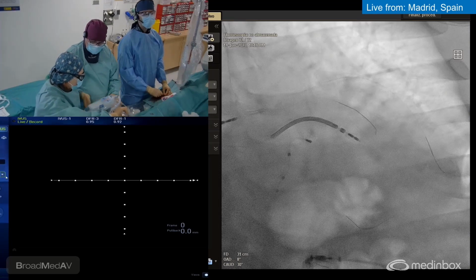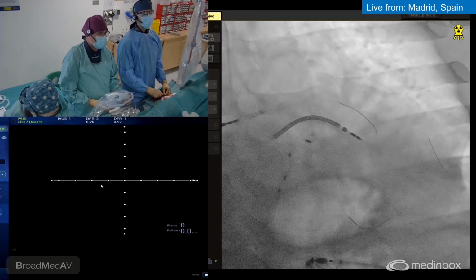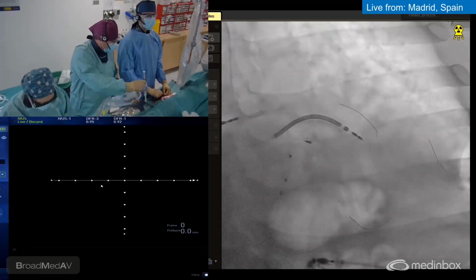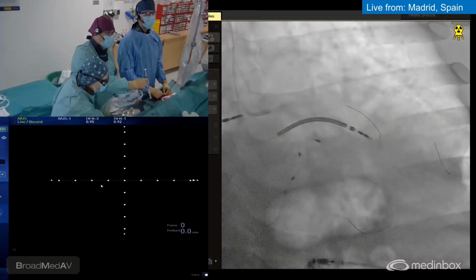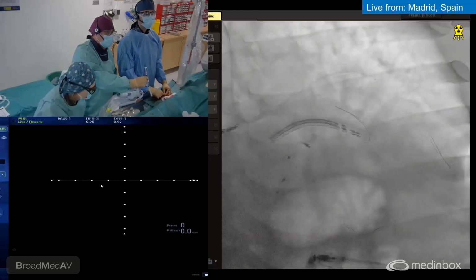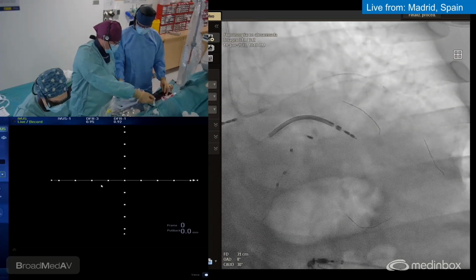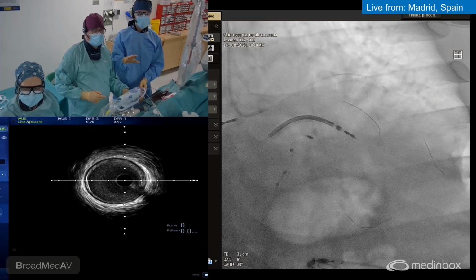I don't know if any of you would have considered leaving this lesion alone and doing a conservative treatment, but with this image, with the angle on the IVUS and this left ventricular dysfunction in this very young patient, for us this approach is better. Okay, live IVUS, please. Wait, pardon. Again, sorry, my fault.